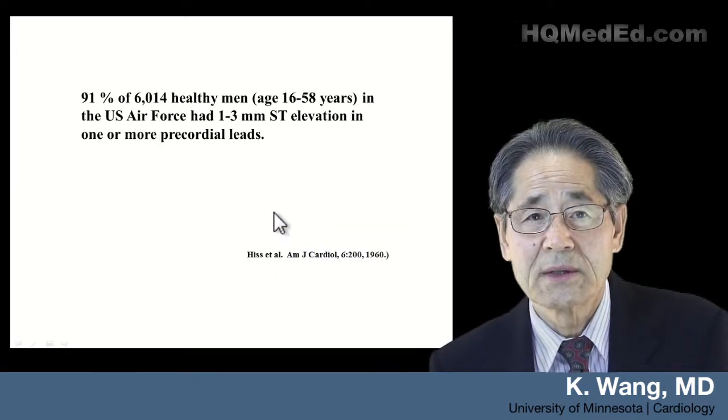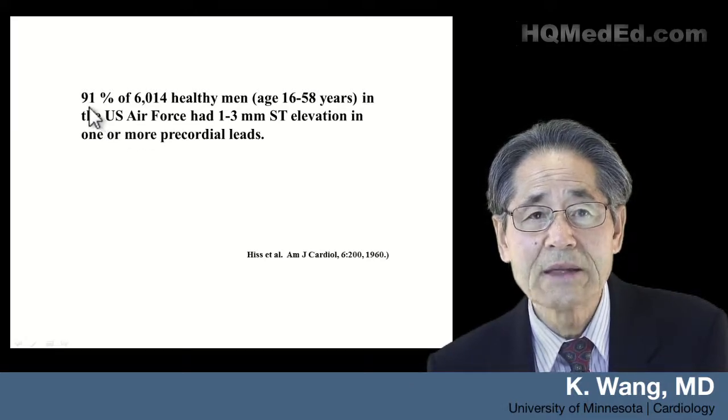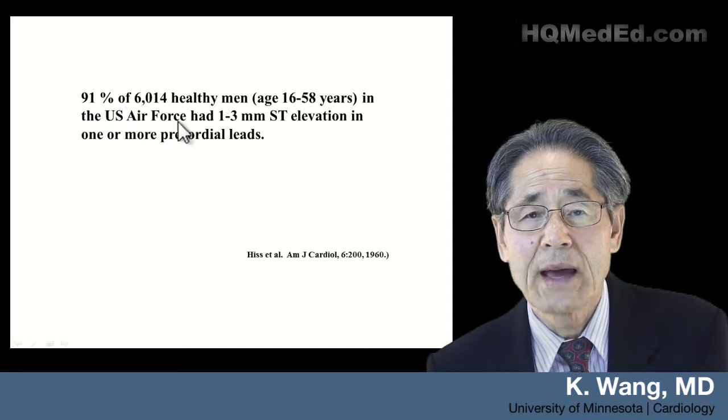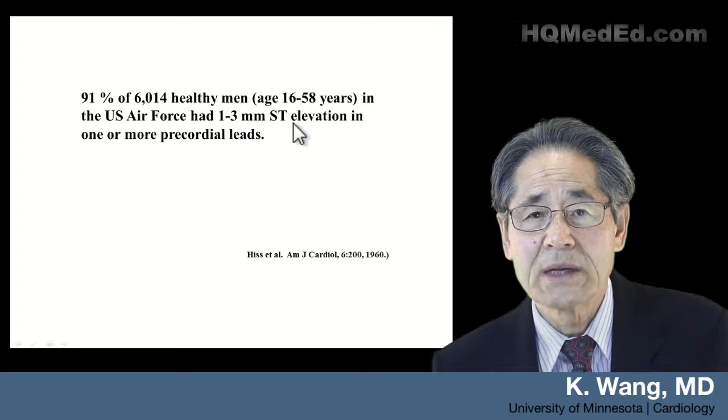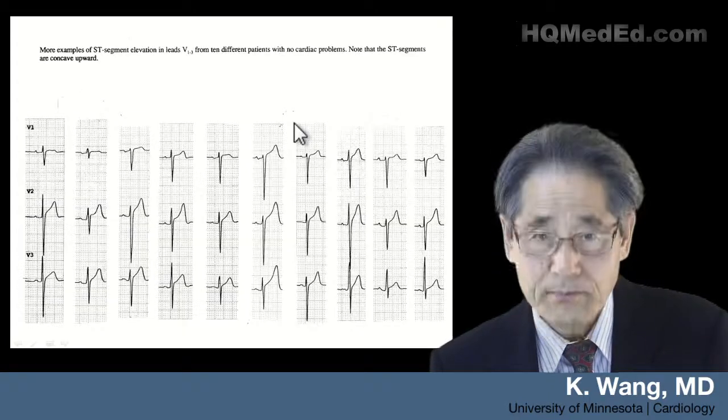Here's another study involving 6,000 healthy men in the U.S. Air Force. 91% of them will have 1 to 3 millimeter ST elevation, mostly in V2.